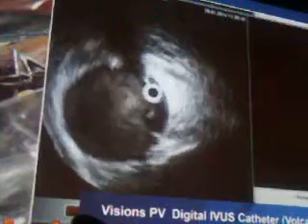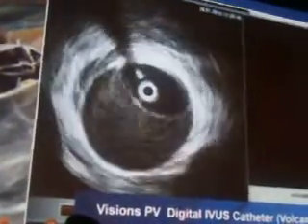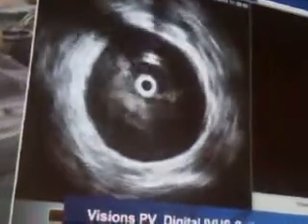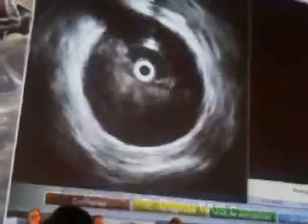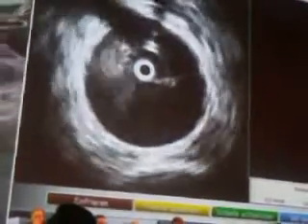What's also very visible here, Andrej, is really the dynamic component of this disease. You can see the membrane moving, consistent with the blood flow into the false lumen. That's also the intention, where we want to change the situation by implanting the stent graft.